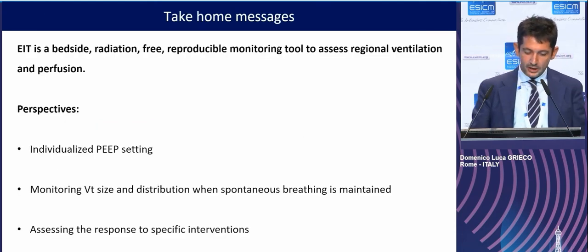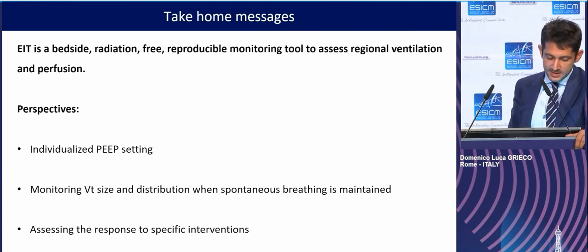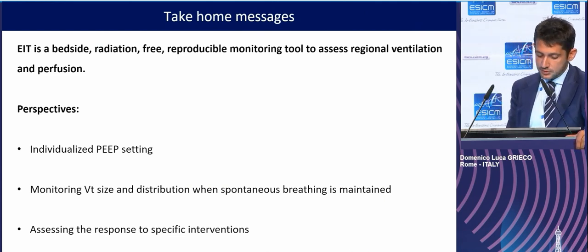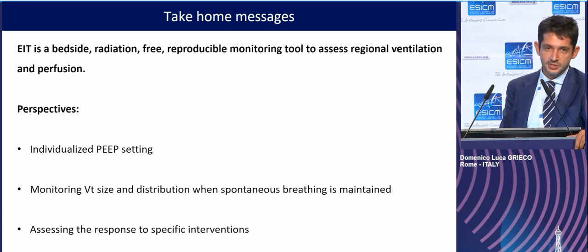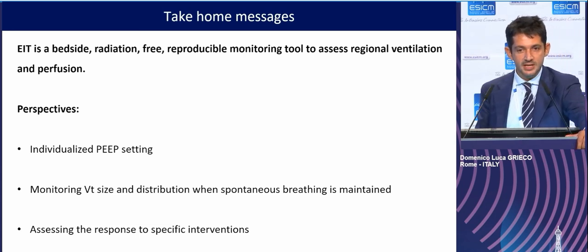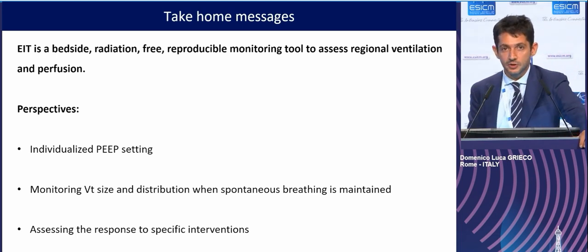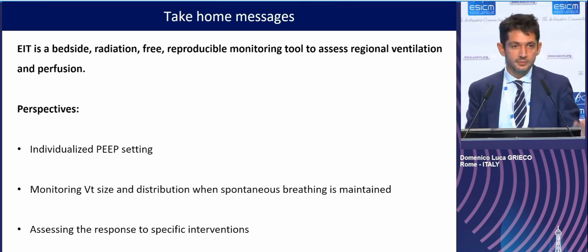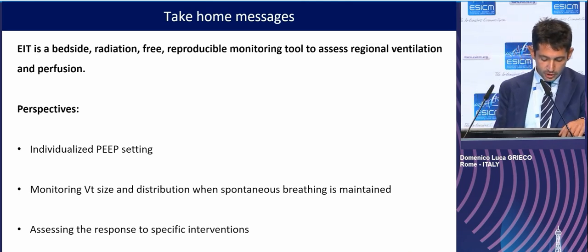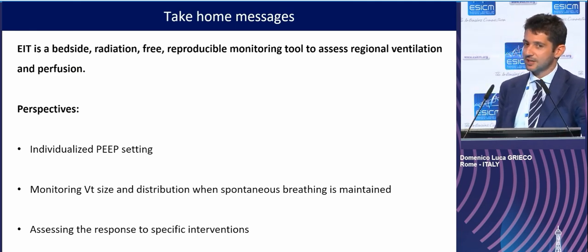So this takes me to my conclusion, and I think that EIT is a physiologically based, bedside, radiation-free, reproducible monitoring tool to assess regional ventilation and perfusion. It's been used mostly for research purposes so far, but it has really important clinical perspectives in terms of customization of care, so to individualize PEEP, monitor tidal volume size and distribution, and assess the response to specific interventions in ARDS patients. Thank you very much.